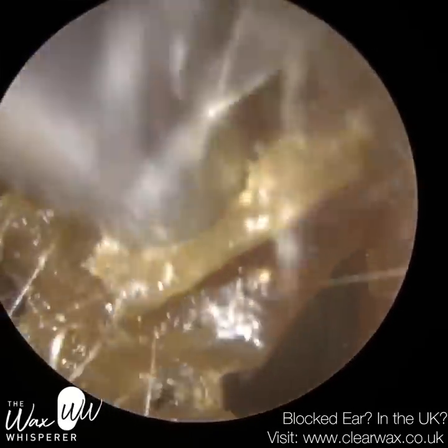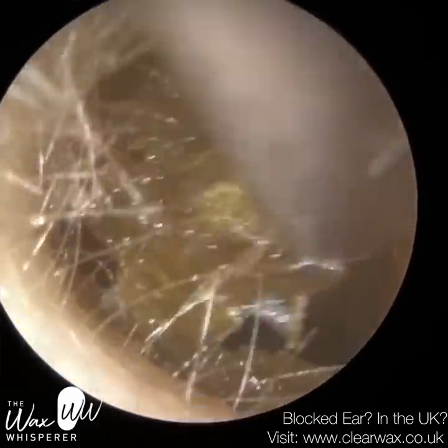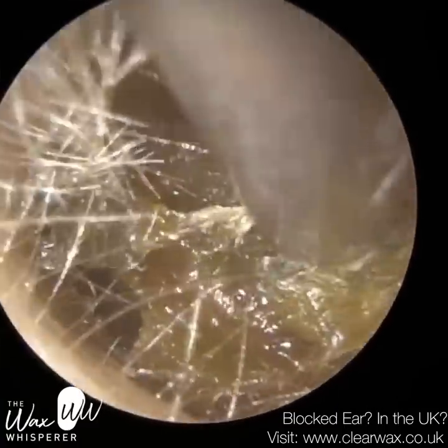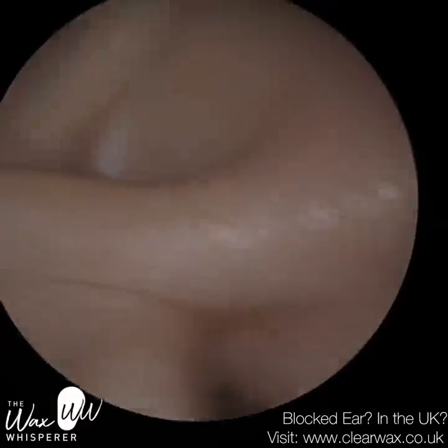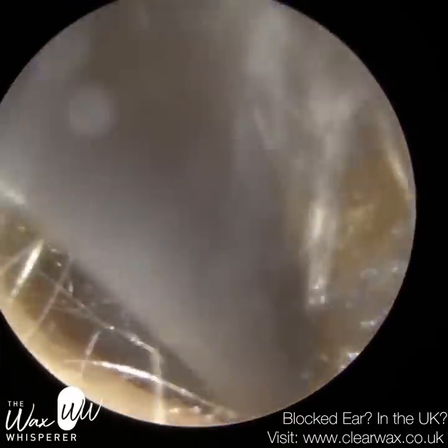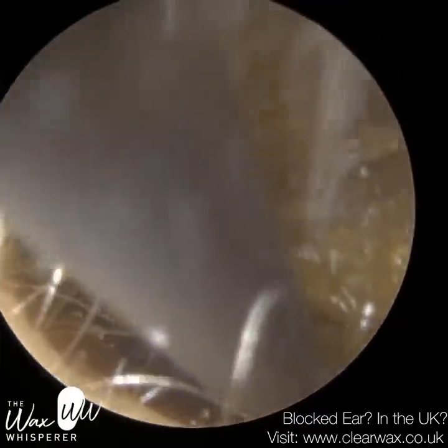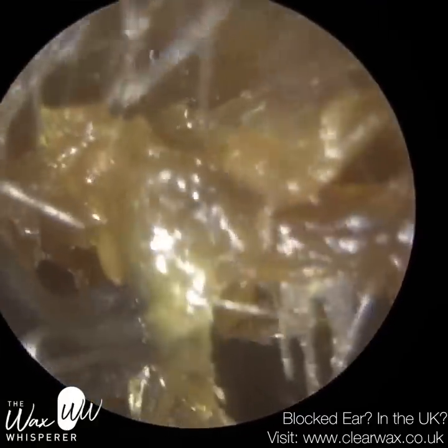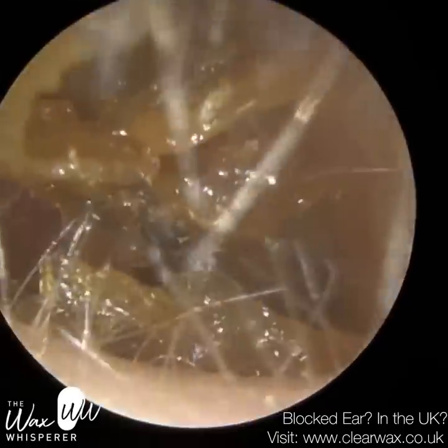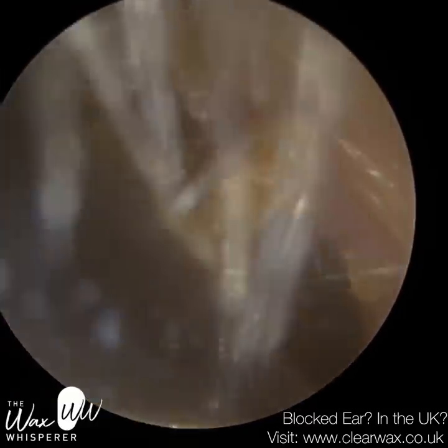This patient has a cartilage graft at the roof of her eardrum where a cholesteatoma normally forms. So what I'm removing here isn't earwax — it's dead skin, really dry dead skin. It's crystallised and I'm just using microsuction there. However, I think I'm going to move on to an earhook, and you'll see it's going to come away in a large singular piece.